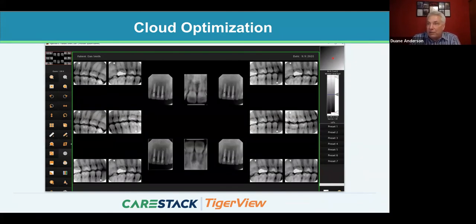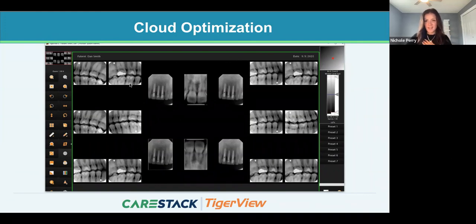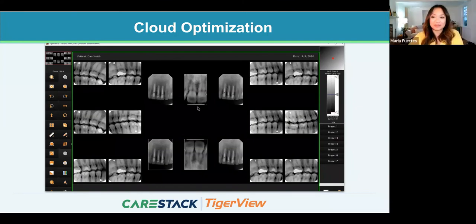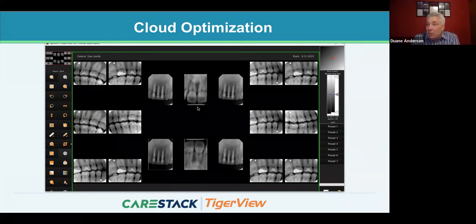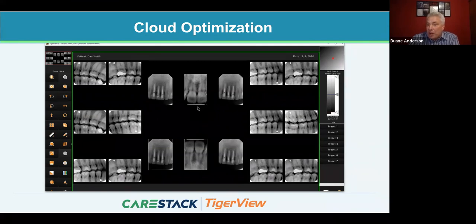Open architecture and direct integration are two phrases people should look for when optimizing their setup. TigerView offers customizable layouts — you can edit them and add your own. Standard layouts include two bite-wing, four bite-wing, and full mouth series. The system automatically adjusts orientation based on the tooth you're selecting, automatically rotates images, and applies tooth numbers based on the action you're taking, making it very easy to set up and acquire using those layouts.